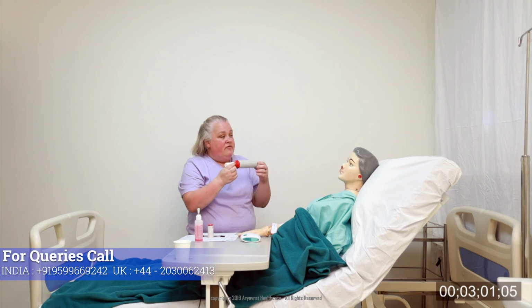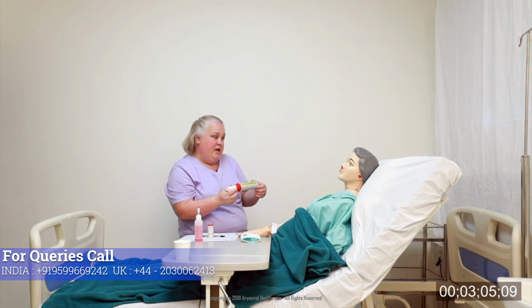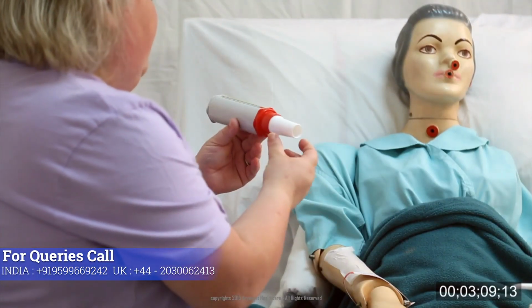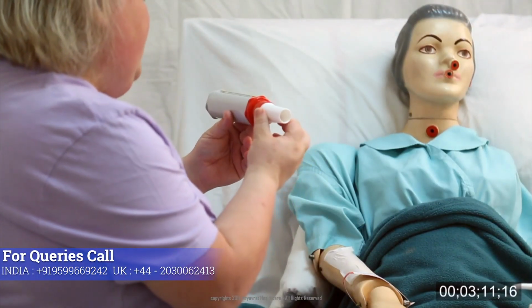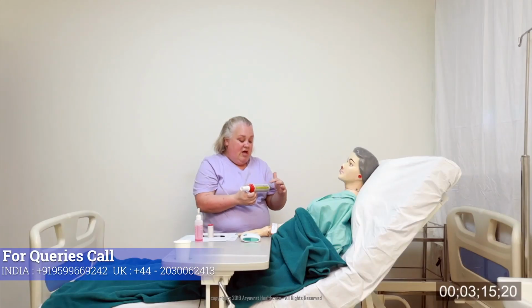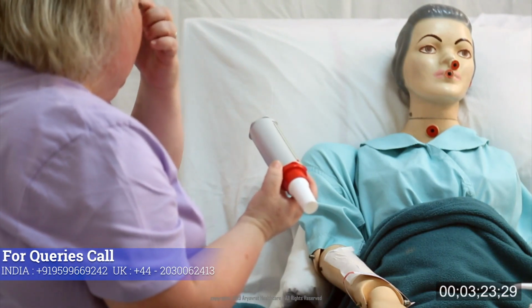This machine will be solely for you and not to be shared by anyone else. The principal parts of the device are the mouthpiece, as I explained, and then the chamber. There is a slide mechanism on the chamber, but it's very important that you don't obstruct it with your fingers, and make sure you don't obstruct the vents at the end as well.